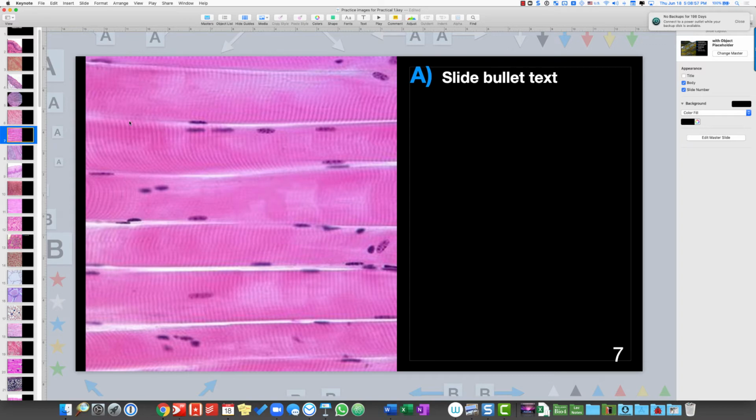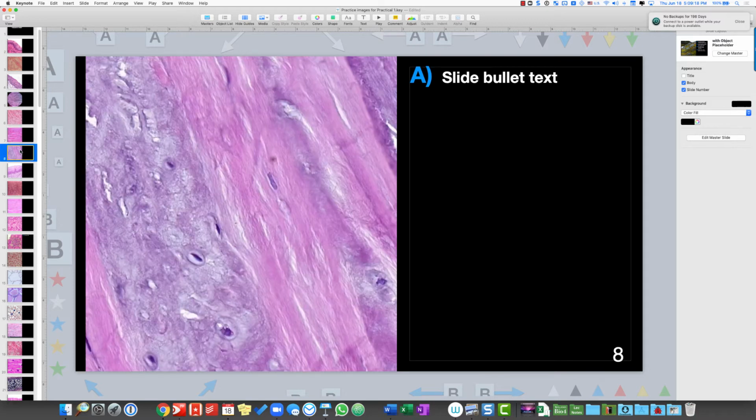This is skeletal muscle demonstrating striation and also multinucleated. Those are some key features, and then you see that these are giant cylindrical cells. They look like cigars. So this is fibrocartilage. Once again, you can see the collagen and then the chondrocytes in lacunae.